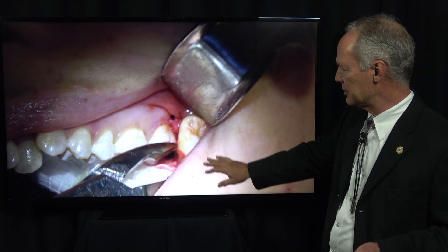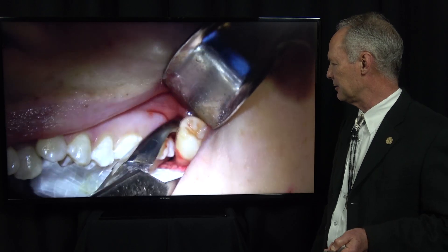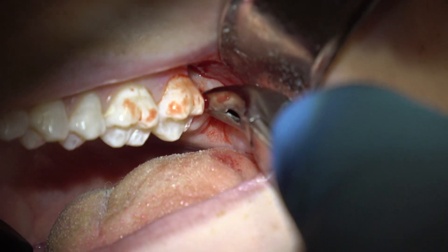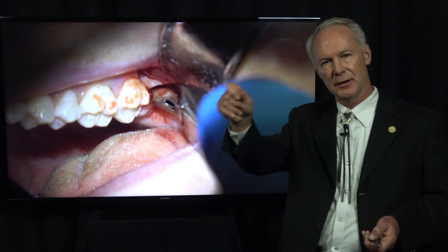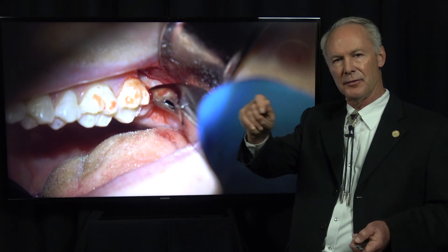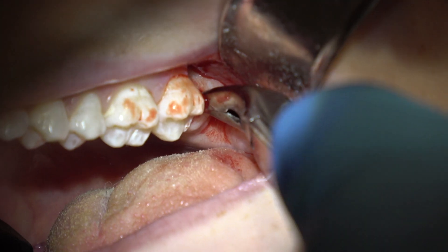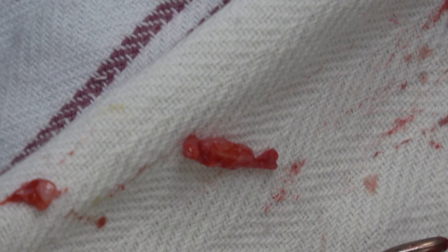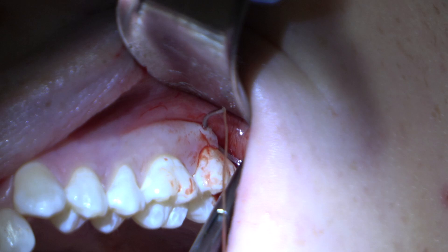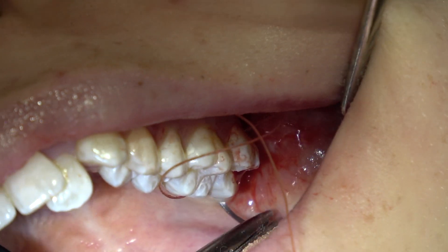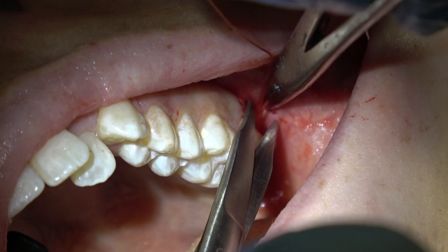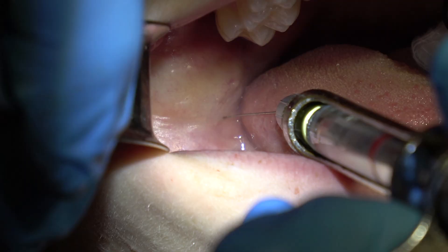You don't want to take a chance on the patient aspirating that tooth. Remember, the bone is a lot softer in the maxilla, so you normally don't have to make a trough around the tooth in the bone. The bone is soft enough that the tooth will compress the bone and just come right out. Unless the roots are fully formed, it will usually just come right out. I'm going back in to remove the follicular sac with my rongeurs, then placing one 3-0 gut suture for both maxillary wisdom teeth.